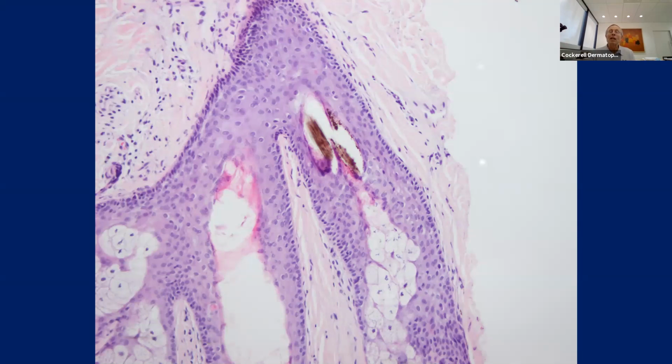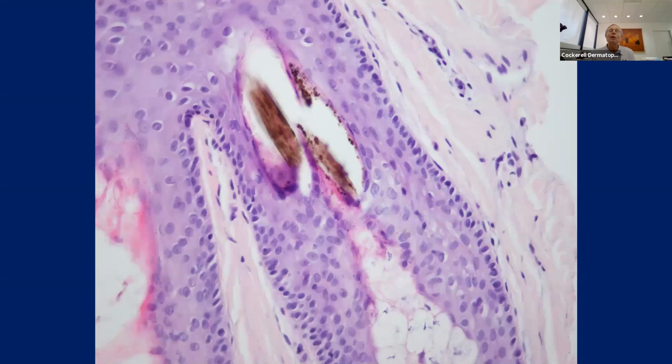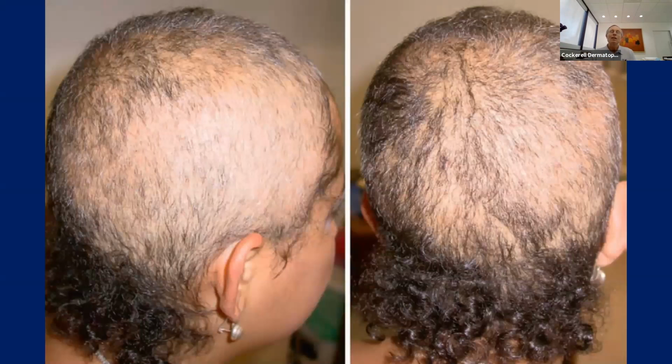So there's trichomalacia, fracture, damage of these hair shafts, and also the sort of shearing of that internal root sheath. So this guy may have been a teenager or something, had some background androgenetic alopecia, maybe whatever, but also was nervous about maybe taking finals and started twisting and pulling on his hair. So we've got basically trichotillomania.